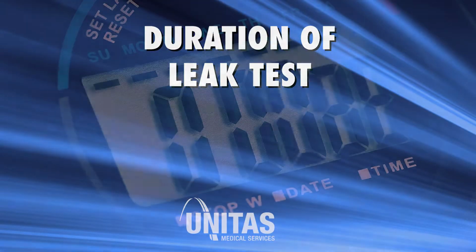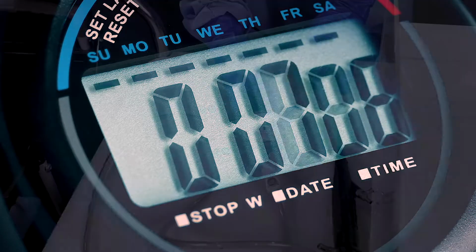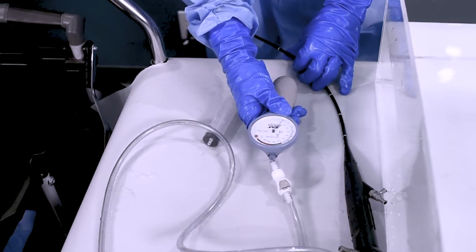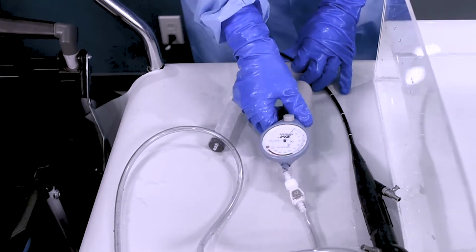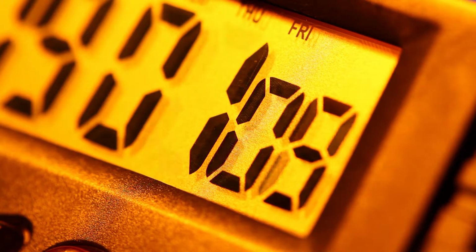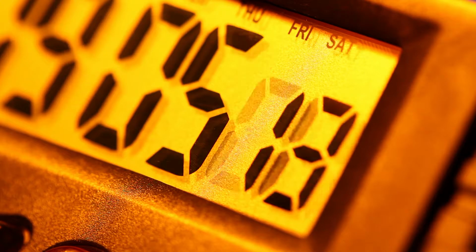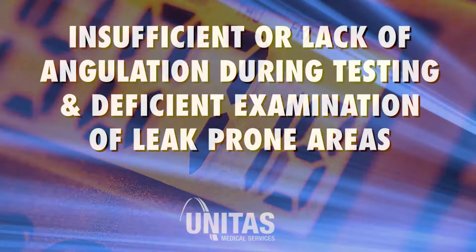Duration of leak test. The leak test time varies from manufacturer to manufacturer. Be sure to confirm the procedure and the required testing time for your specific models. Cutting test time decreases leak detection accuracy. Be aware, small internal leaks may take additional time to reveal themselves. Testing time should be verified with utilization of a timer or clock with a second hand.